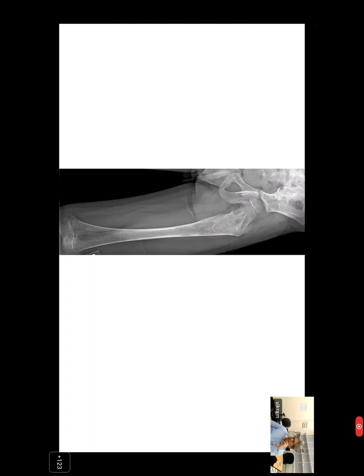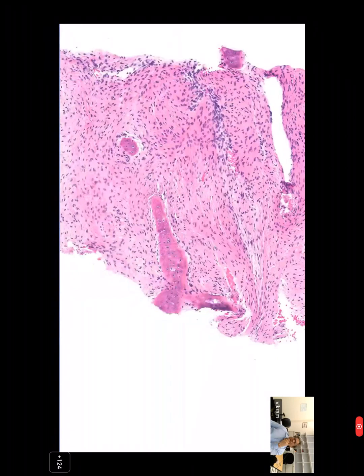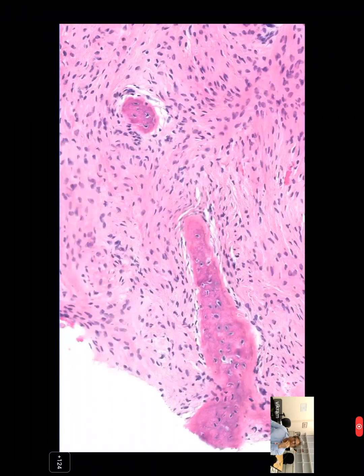So Sharmila, are we thinking benign or malignant? I'm thinking it's benign, sir. Okay, good. So now you have your histology. Let me just flip through the images really quickly. Right, so those are the images we have. Do you want to start describing it?